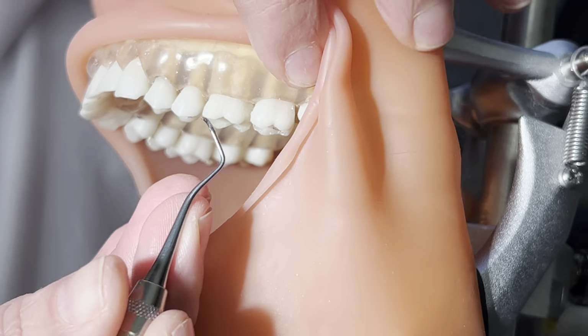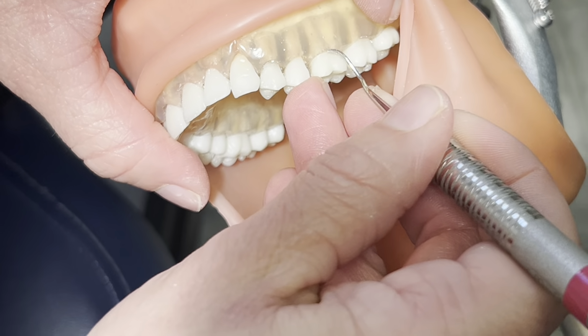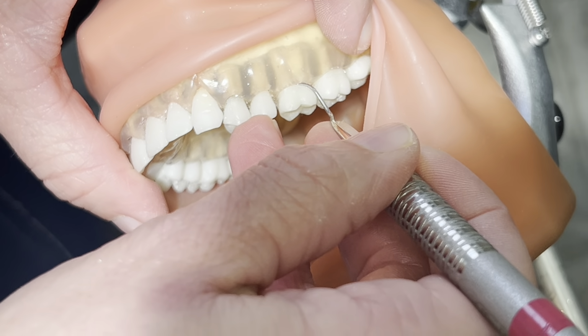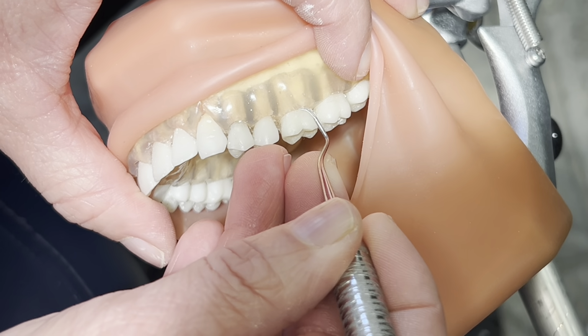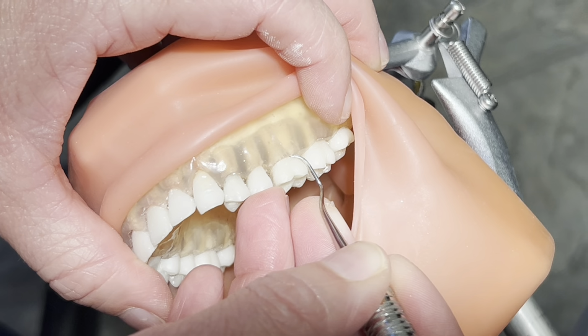Looking at the buccal and lingual surfaces, we're again starting with 90 degrees. So it's going to look something like this. And again, watch the heel. The heel is going to come closer to the tooth when you close in on 70 to 80 degrees.